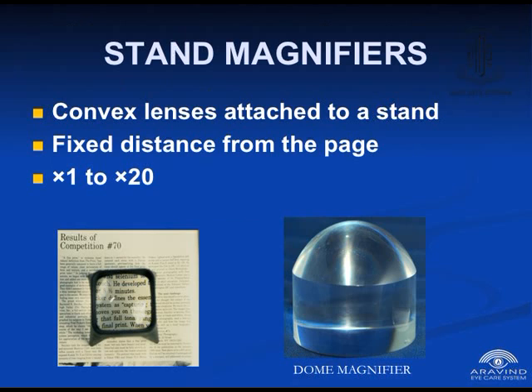You have stand magnifiers also, for patients who have difficulty with poor hand-eye coordination. A stand magnifier is a dome magnifier where the light is diffusely focused on the reading material.